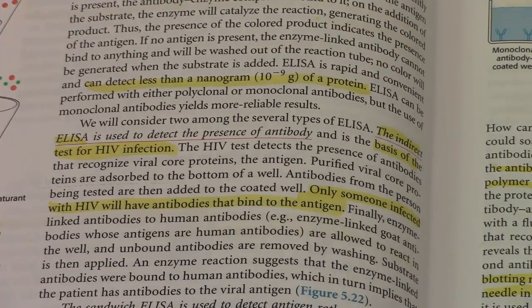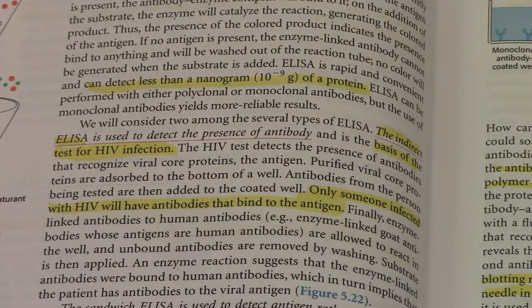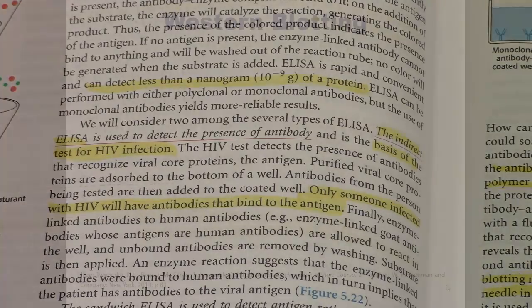Finally, enzyme-linked antibodies to human antibodies are allowed to react in the well, and unbound antibodies are removed by washing. Substrate is then applied. An enzyme reaction indicates that the enzyme-linked antibodies were bound to human antibodies, which in turn implies that the patient has antibodies to the viral antigen.